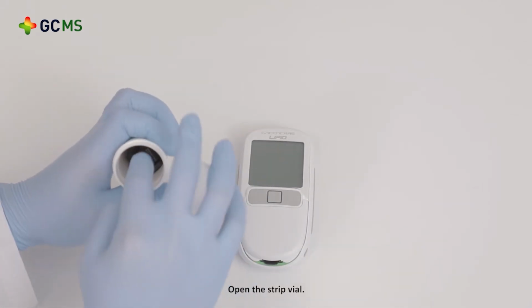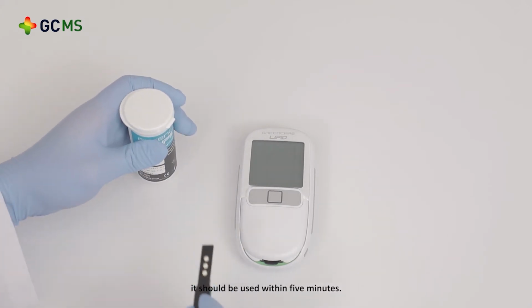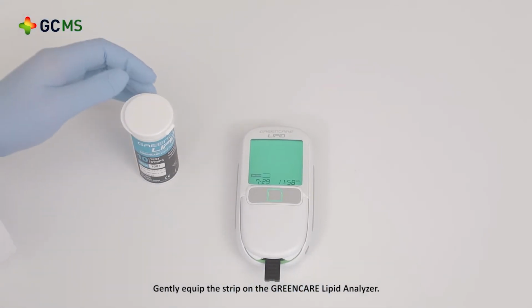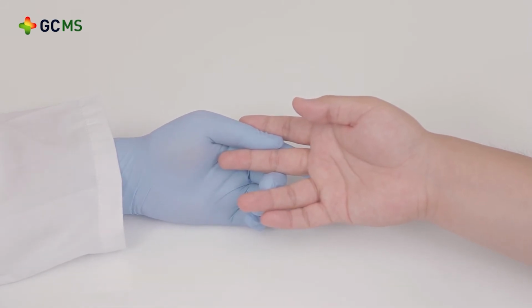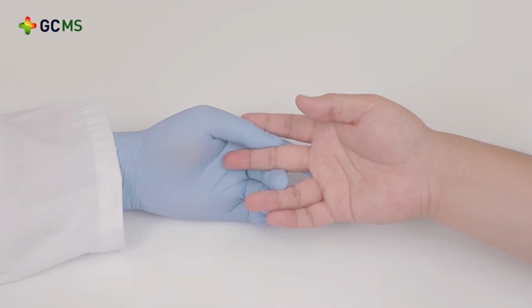Open the strip vial. Once the test strip is taken out of the vial, it should be used within 5 minutes. Gently equip the strip on the GreenCare Lipid Analyzer. Do not touch the strip scan area. Select the puncture site at the tip of the middle finger of either hand. Using the alcohol swab, clean the finger and allow it to dry completely.